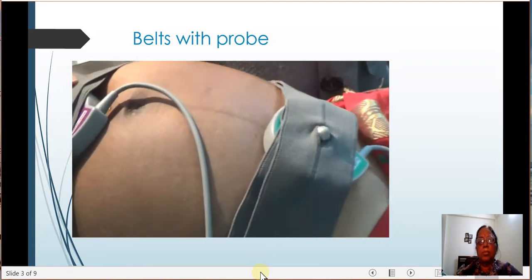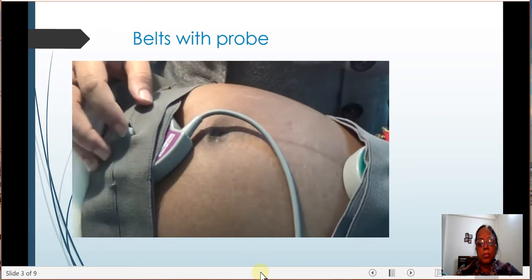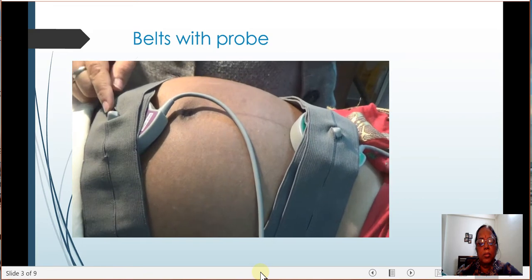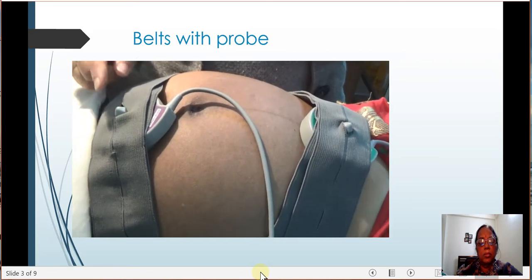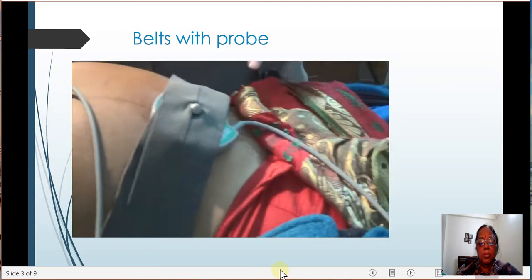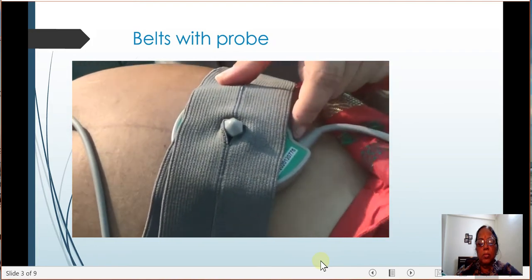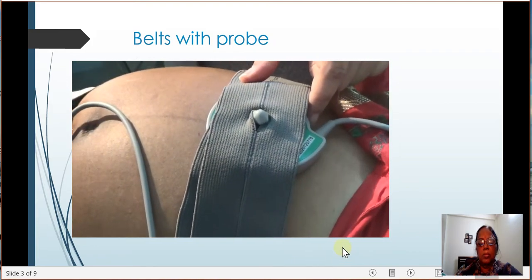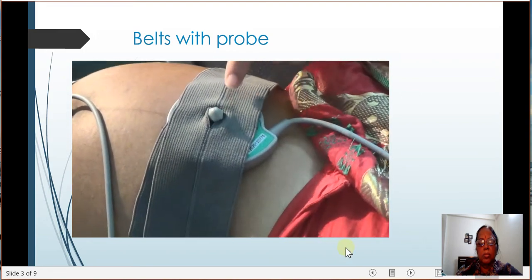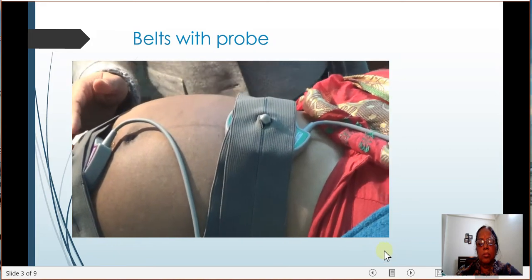One is the USG transducer, which I have already shown you. That was purple in color. Over here we can see. Before establishing the position of the USG transducer, you have to locate the fetal heart rate, because this transducer is going to pick up the fetal heart rates. The second transducer which we have already seen was the toco transducer. The toco transducer is said to record the uterine contractions. For this, you have to place the toco probe at the highest point on the fundus. After attaching these two probes, we are going to check on our machine.